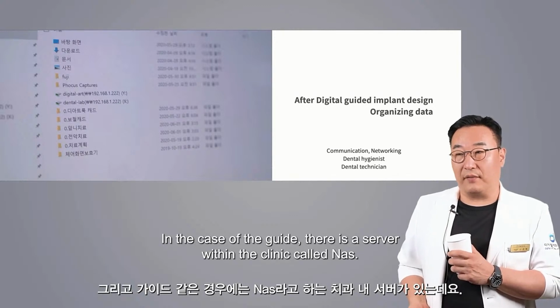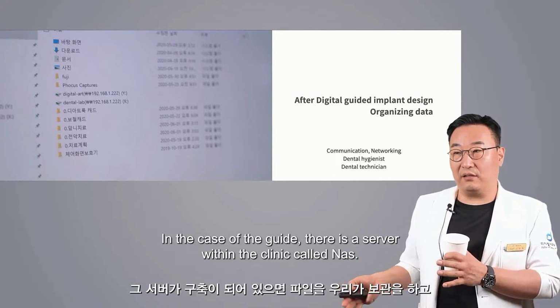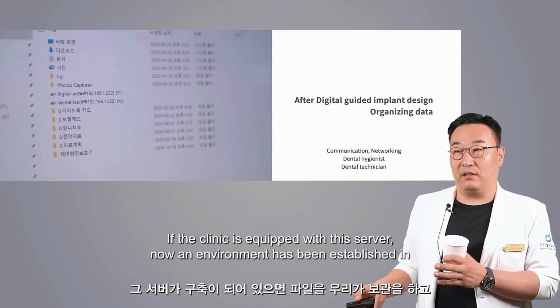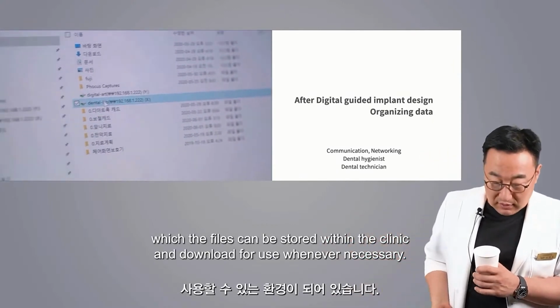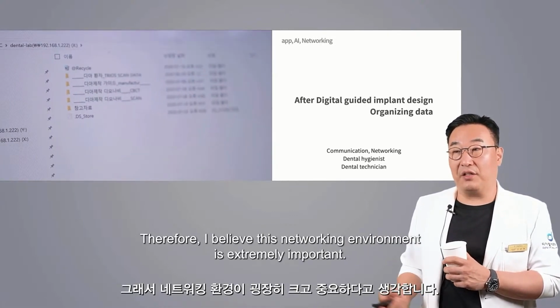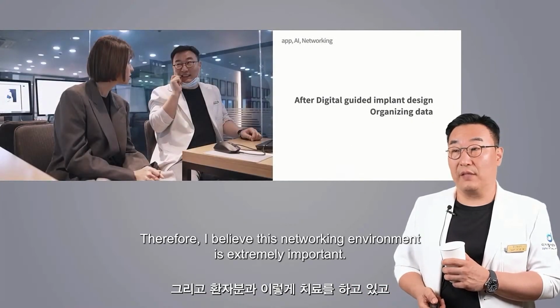In the case of the guide, there is a server within the clinic called NAS. If the clinic is equipped with this server, an environment has been established in which the files can be stored within the clinic and downloaded for use whenever necessary. Therefore, I believe this networking environment is extremely important.